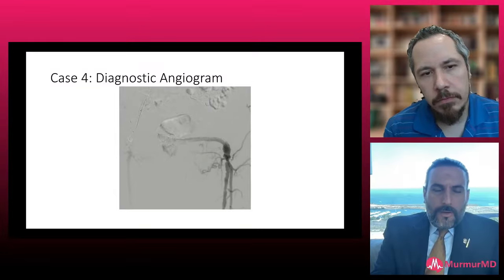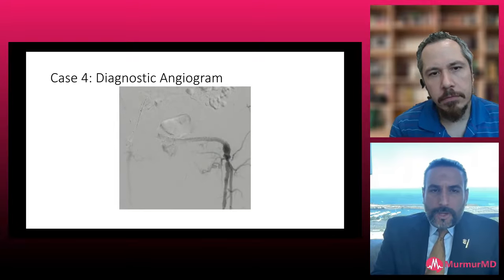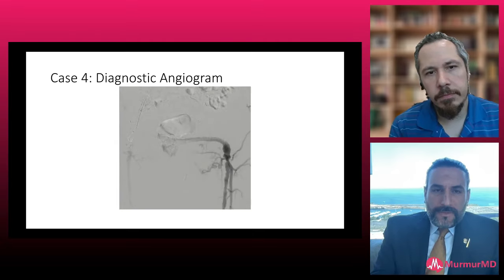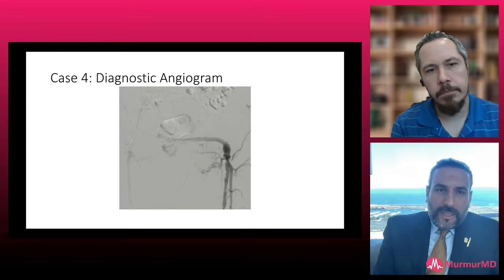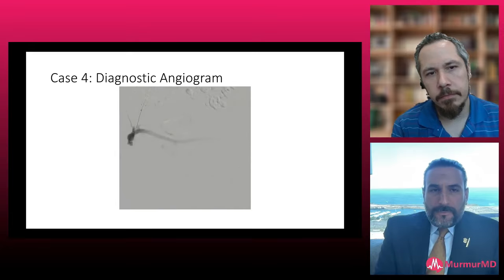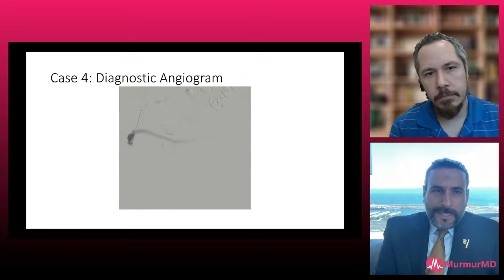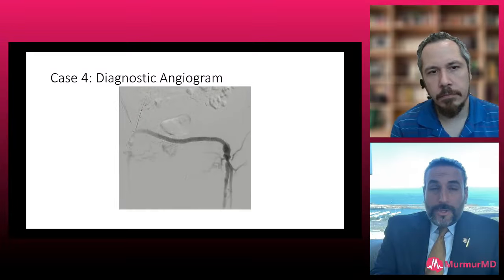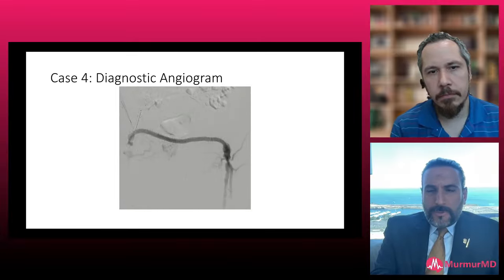Yeah, no, I mean that's obviously a critical stenosis versus an occlusion of this. It looks like distal common femoral artery, and I agree with you. I don't see the profunda either. Now, given the fact that there was redo surgery there, and there's a fem-fem, I think an opportunity to get this patient out of that lifestyle limiting claudication in a minimally invasive manner is completely reasonable. I think the possible complications that could occur from redo open surgery in that groin outweigh the benefits from doing this open.